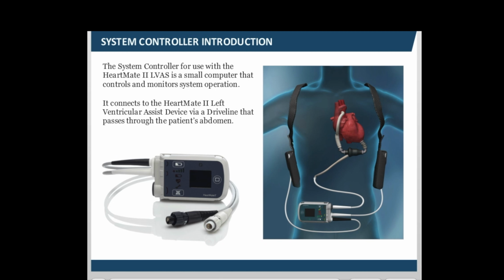The system controller has two power cables, one with a white connector and the other with a black connector. The power cables connect to the power module, a pair of 14-volt lithium-ion batteries, or the mobile power unit module for use with the HeartMate 2 LVAS. When connected to a working power source, they provide external power to the pump via the driveline. While both cables provide equal power, the white power cable also transmits data from the system controller to the system monitor for use with the HeartMate 2 LVAS when it is connected to the power module patient cable.